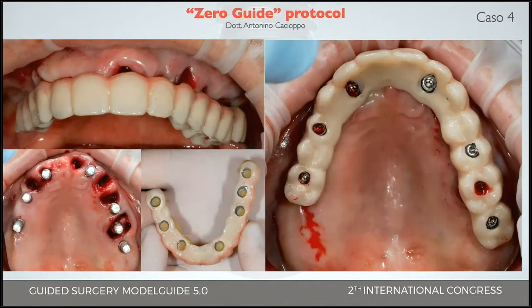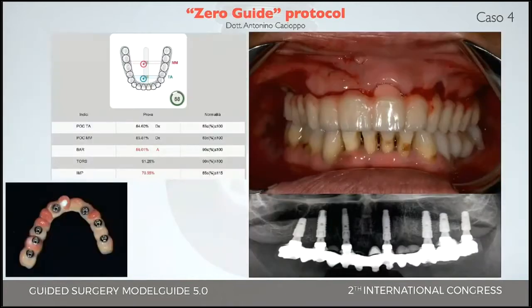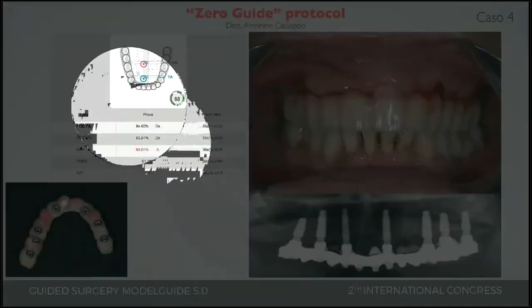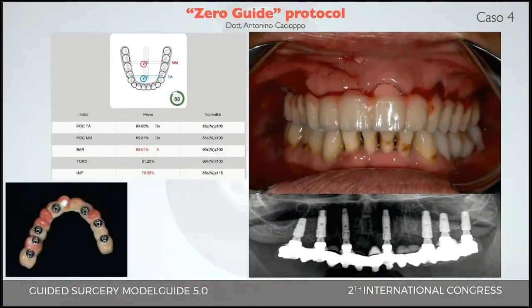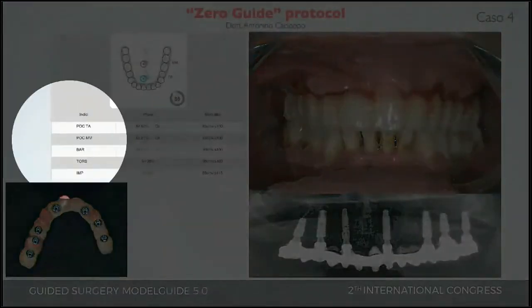But it's not only related to aesthetics. I don't care about aesthetics in these cases. In these steps, of course, at the end of the process, I want a better gum, I want better aesthetics, and I want to finish for my congresses. Why not? But this is the day of the surgery, and this is the Teethan during the day of the surgery, at the end of the day. It's not easy, but I maintain all the parameters I had before in my try-in and also a lower impact.